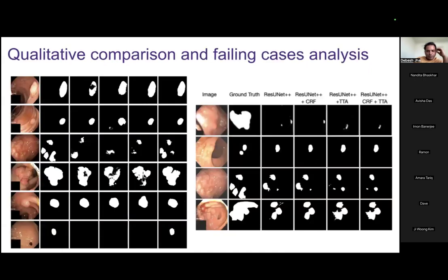This slide is interesting because this was my initial work, and when I showed this slide to a doctor, for example, for these kinds of cases, these are easy to detect polyps, so anyone can know it is a polyp or a colorectal cancer. But for cases like this, where this is the ground truth, no other model could detect it, and ResUNet plus plus could detect it. So it has some clinical significance. This is also a reason why it became more popular.